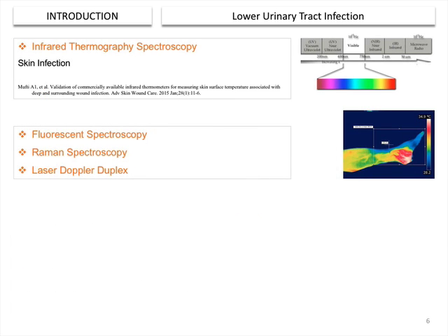The current trend of diagnostics in medicine, the futuristic trend, is changing from invasive procedures to semi-invasive, and from there to non-invasive, and these days they are even talking about non-contact procedures. It means being able to get information about the integrity of the tissues and organ functions without approaching the integrity of the tissue, getting a biopsy or even body samples. And here, many of the modern optics and photonics methods are good fits.